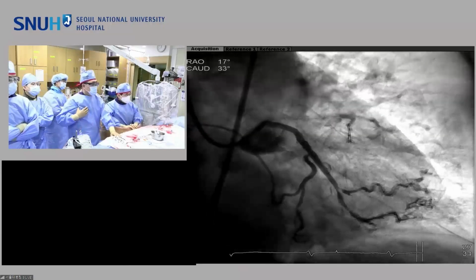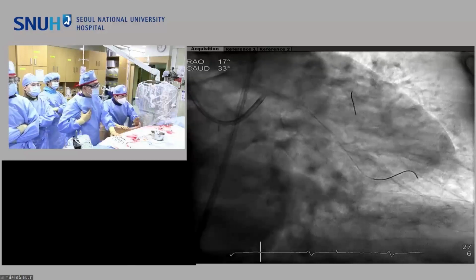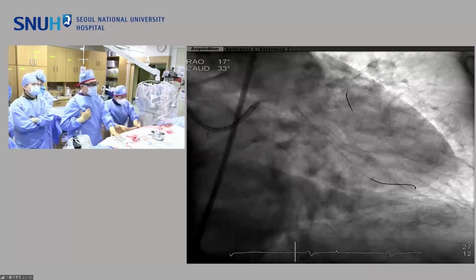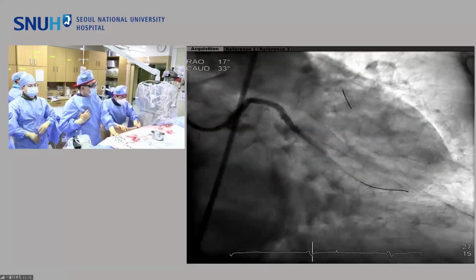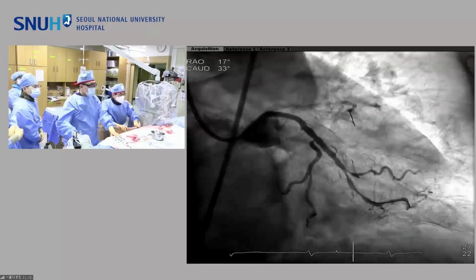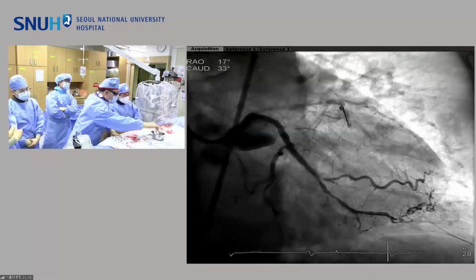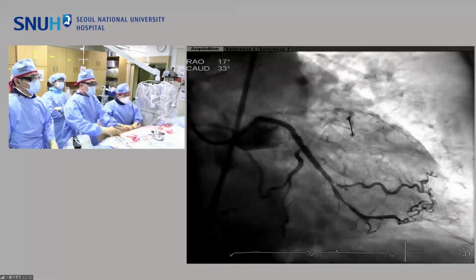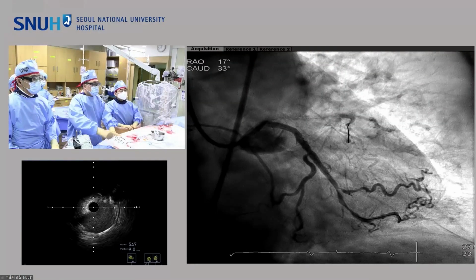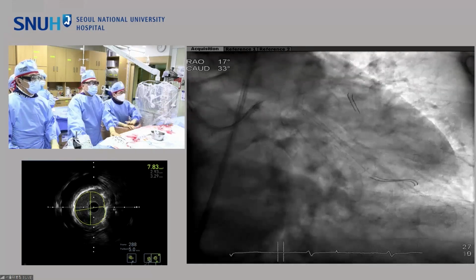Due to the error, just please wait a little bit to exchange the picture from angio to IVUS. So in a case like this, the lithotripsy will help in case of unexpanded stent. Our preferred approach here, again, I think this is really nice, elegant that you can do this with a nice high pressure balloon. In the United States right now, I think most people would treat this with IV lithotripsy, and you can get IVUS through once again.